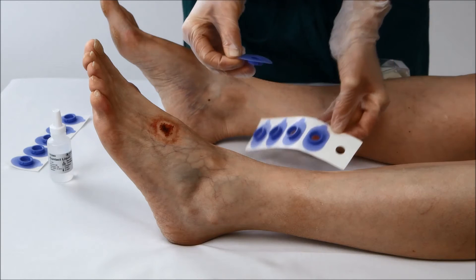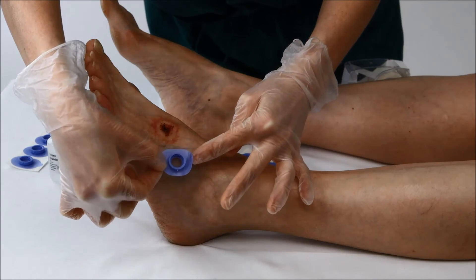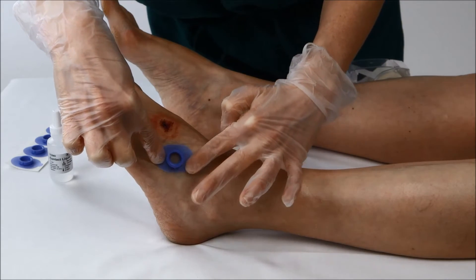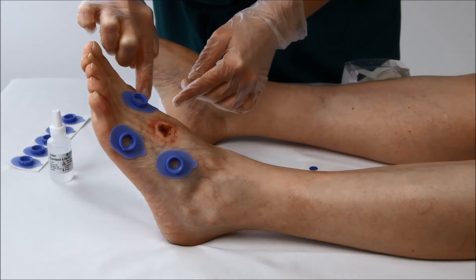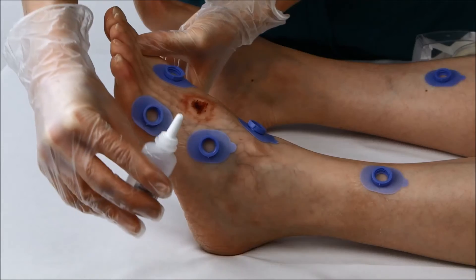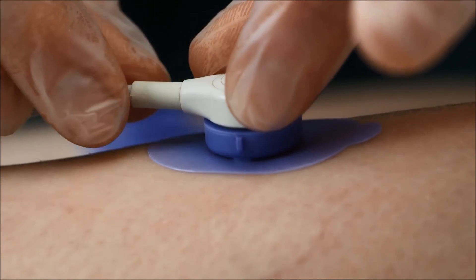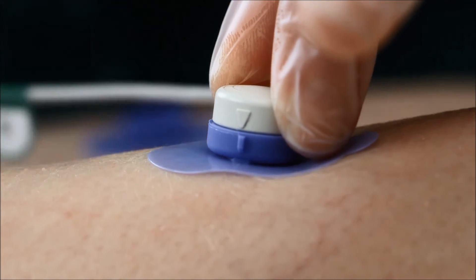Next, attach the fixation rings to the skin, either TC-550 or Extra Strength Adhesive TC-555. Place the ring on the patient and make sure you have good adhesion around the ring to create the important airtight seal. Add three to five drops of contact liquid. Insert the electrode head, and to lock it in place, turn it a quarter turn clockwise so that the arrow aligns with the tab on the ring.